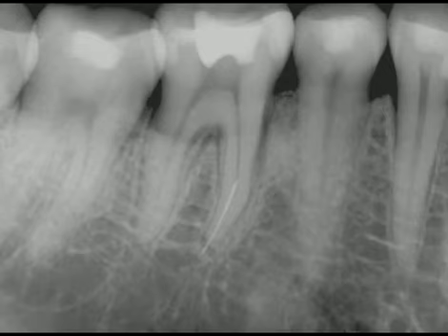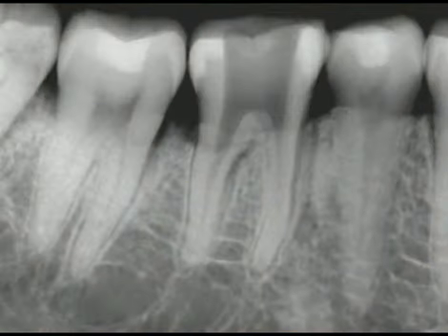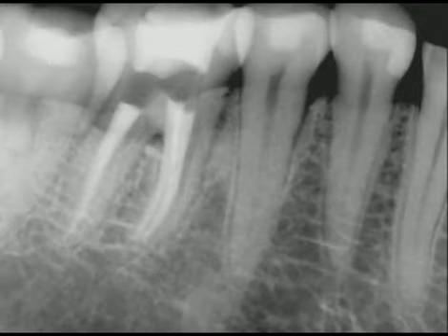In this preoperative film of a mandibular first molar, notice a broken instrument in the apical 1/3 of the mesial root. Notice the root is thin, and the angle between the file and the coronal 2/3 of the canal. A photograph shows straight line access and the head of the broken NiTi file predictably lying on the outer wall. I utilized a prototype IRS device to scoop up the obstruction, and a subsequent radiograph confirms the removal of the broken file. The post-treatment film demonstrates the pack.